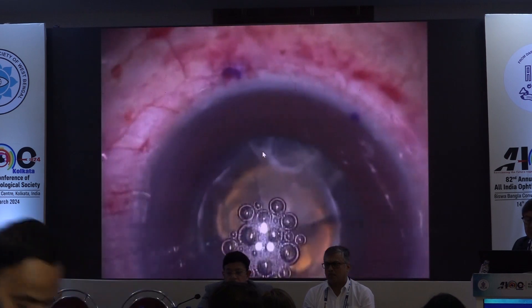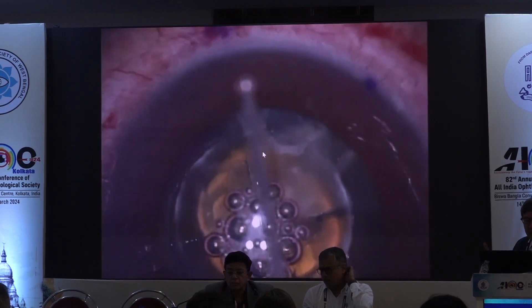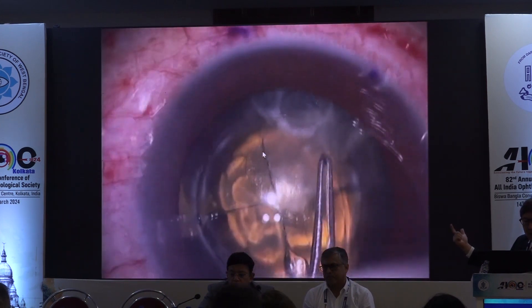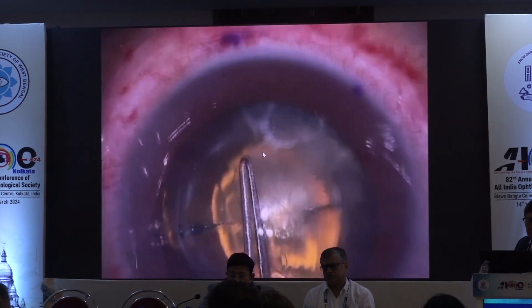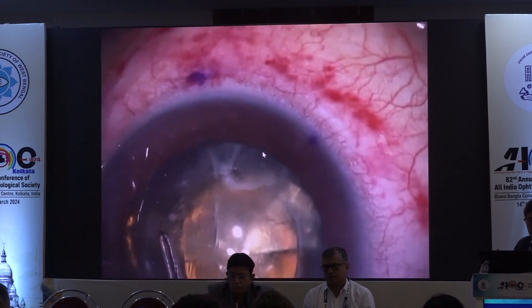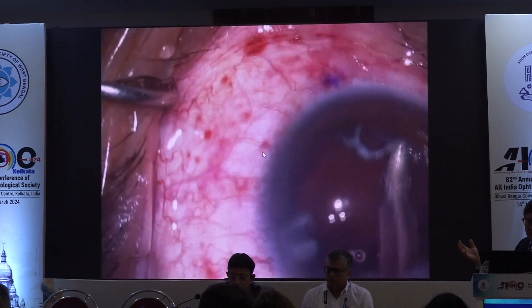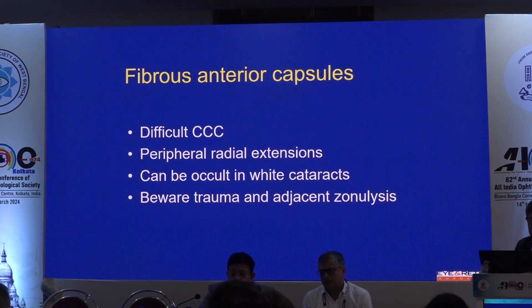Finally, I think FLACS is quite a nice thing to do when you have a fibrous band. The question is: has it cut through only the capsule, or has it cut through capsule and fibrous band? Don't know — let's try. I pull the capsulorexis and you can see it's coming away quite nicely over the fibrous band. So you don't always need to go through the fibrous band. If the eye is kind to you, you can tear the capsule over the band, and at the end of surgery that original fibrous band is still intact.